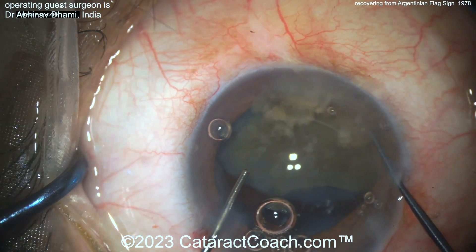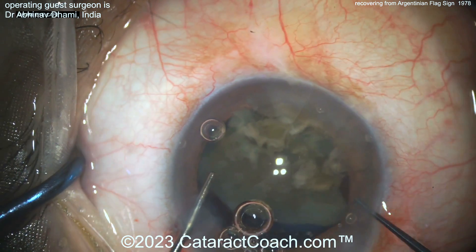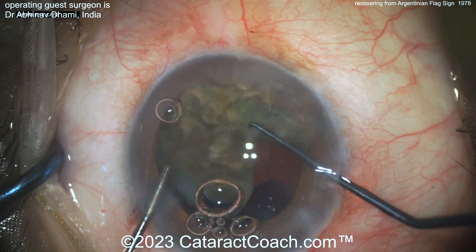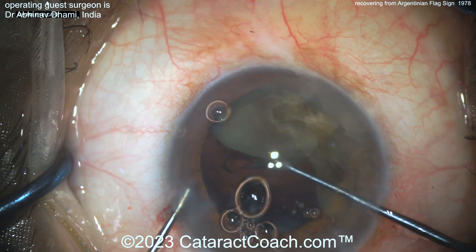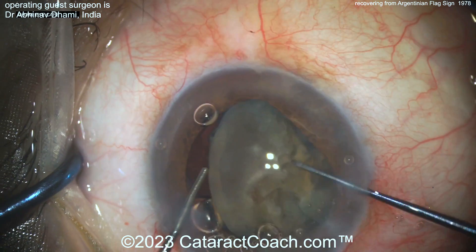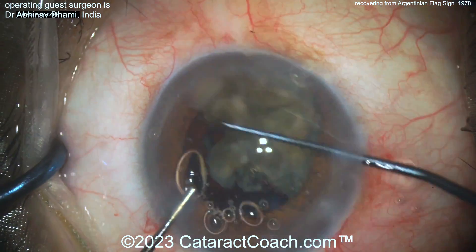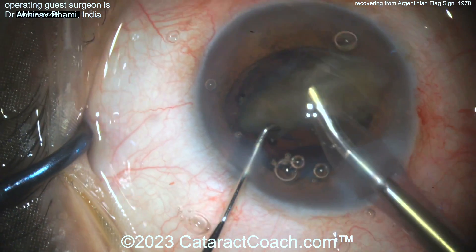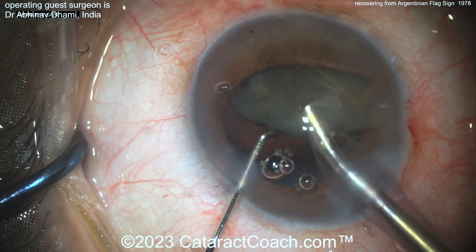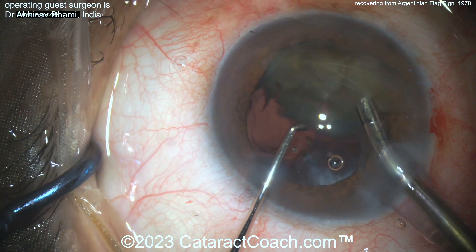You might say, 'I'm going to put too much energy close to the endothelium' — well, it's a give and take here. A young patient probably has a stronger endothelium than a stronger capsule, because in this case the capsule is clearly weak. Now we've got this iatrogenic issue of the runout, making it much weaker. You can chop it right here using the cannula in the chopper — no fancy instruments needed. Aspirating the cataract while staying away from the bag. That clear red reflex makes my heart sink a little bit.